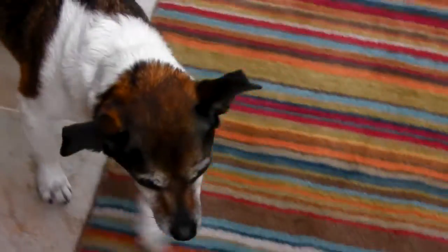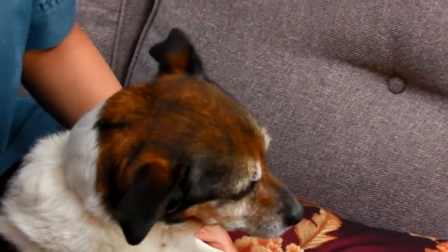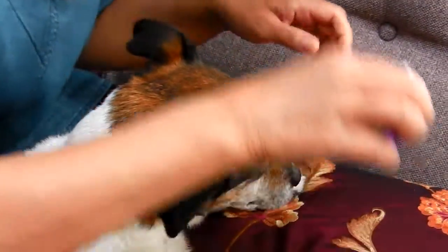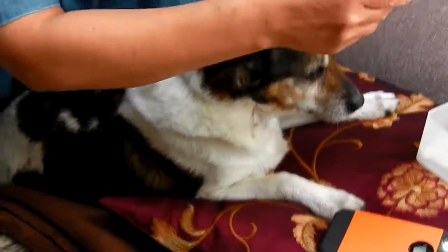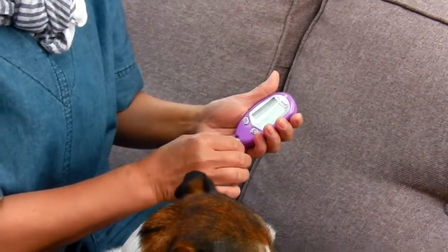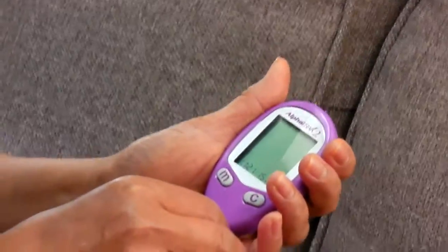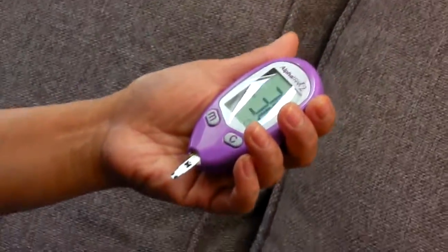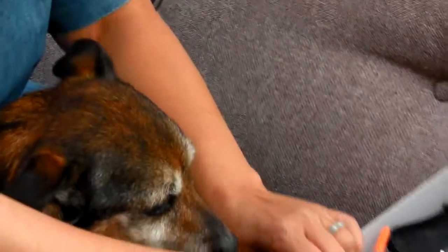Delica, good girl. Today you're going to have a blood glucose check again, okay? Good girl. I have to prepare — look, the BG meter is out again. Get ready, make sure it's set. The dog is 36, okay. Leave it on the corner on the side.